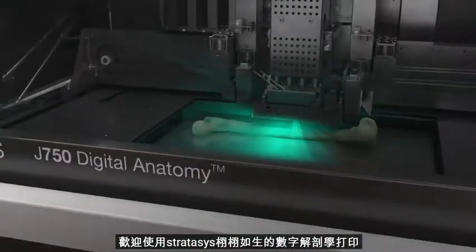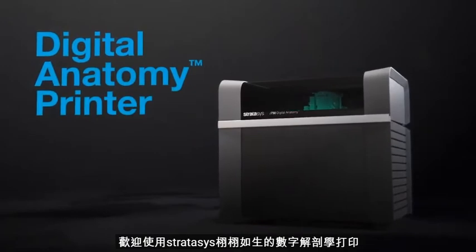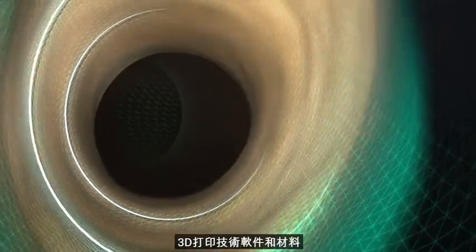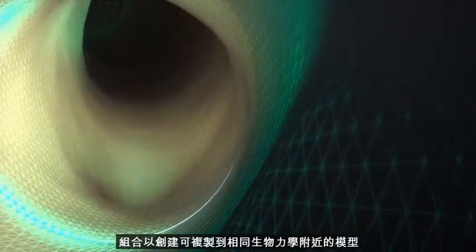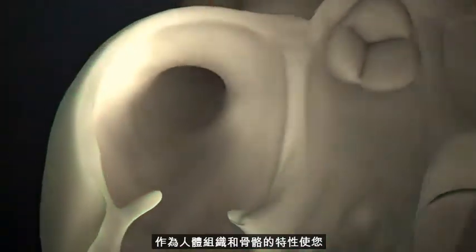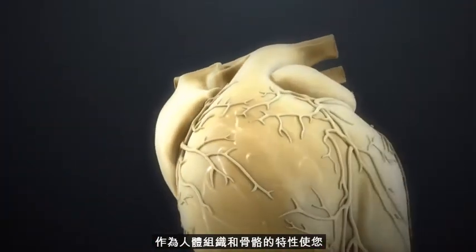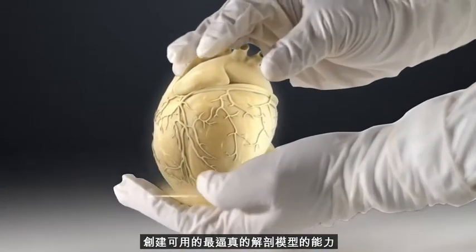Welcome to lifelike digital anatomy printing by Stratasys. 3D printing technology, software, and materials combine to create models that replicate close to the same biomechanical properties as human tissue and bone, giving you the power to create the most lifelike anatomical models available.